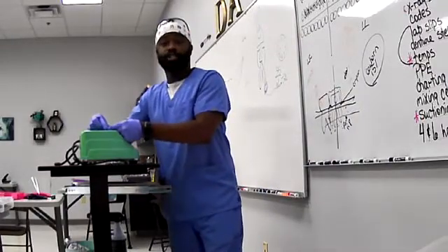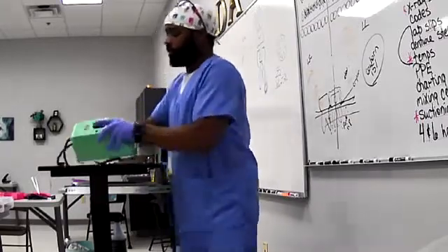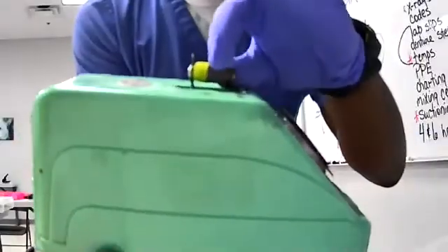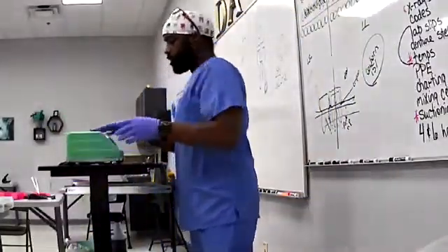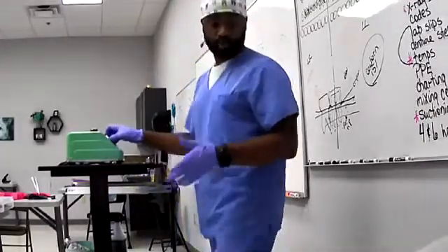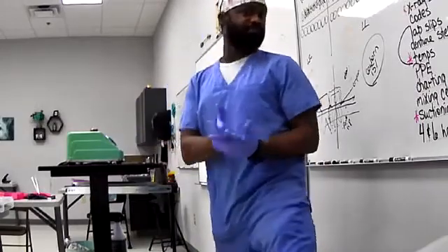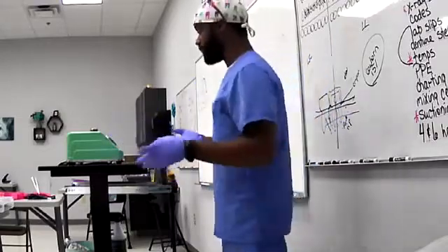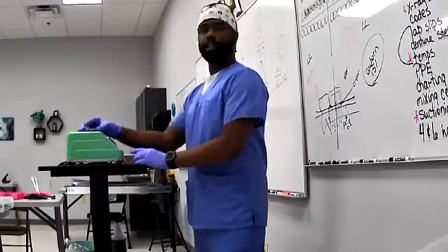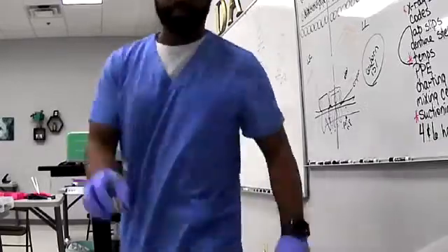And tomorrow in class, I'll show y'all that way you can see it up close, because I know you can't really see the whole thing. But you'll put the capsule into the amalgamator like that. You just pop it in there. You'll turn it on for however long the dentist wants it shaken. Dentists normally put it between, I would say, 13 seconds to 24 seconds. I've done 23 seconds today. Turn it on, shake it. It shakes real good, mixes everything together.